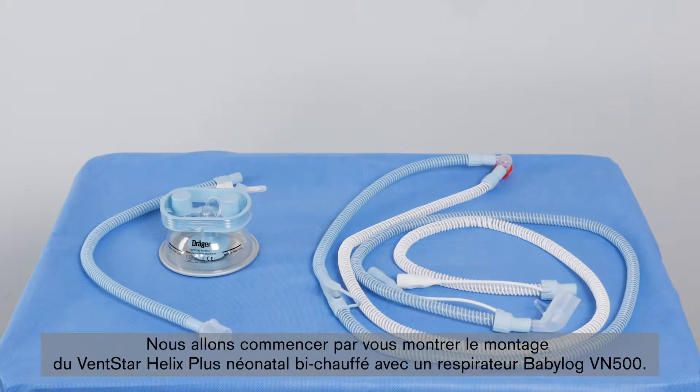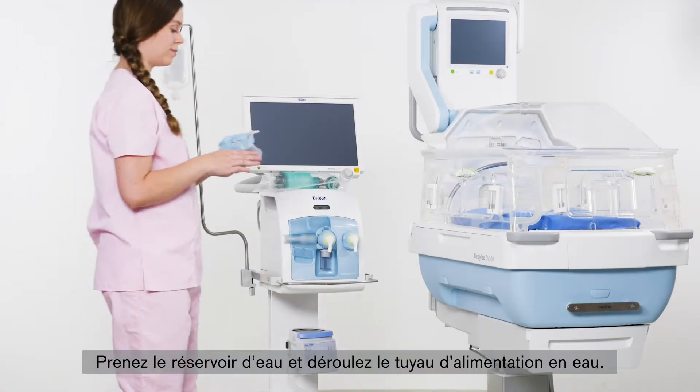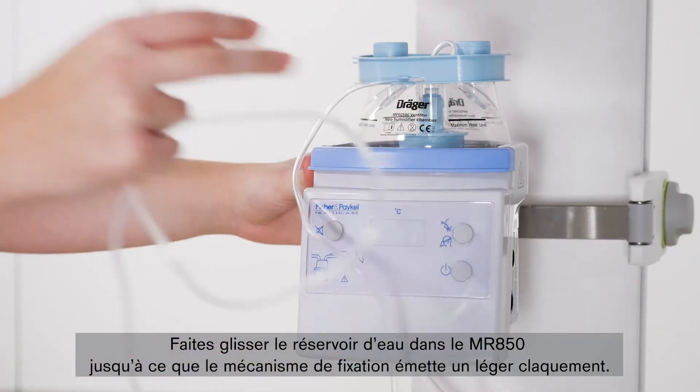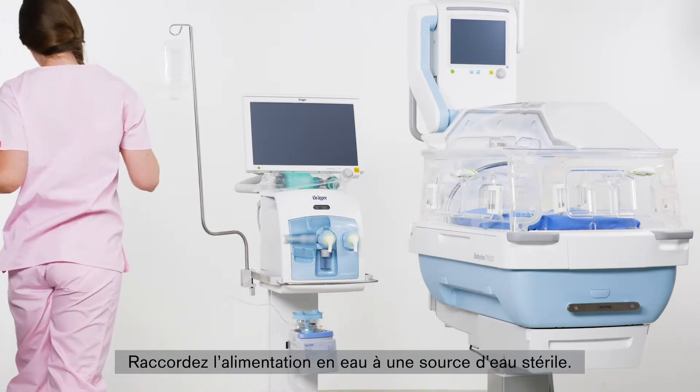First, we will show you the setup of the VentStar Helix Dual-Heated Neonatal Plus with a Babylog VN500. Take the water chamber and unwind the water supply hose. Slide the water chamber into the MR850 until the interlocks snap into place. Connect the water supply to a sterile water source.